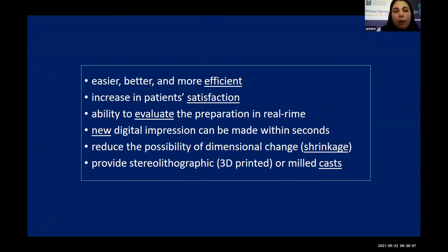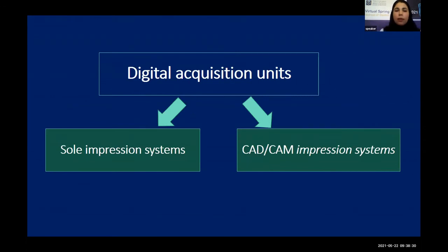There will be the possibility to evaluate your preparation in real time. And it's obvious that the possibility of dimensional changes, the shrinkage, will be reduced. And milled cast or 3D printed cast may be fabricated.